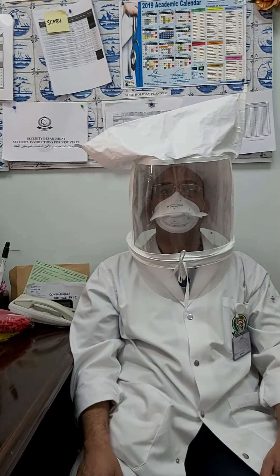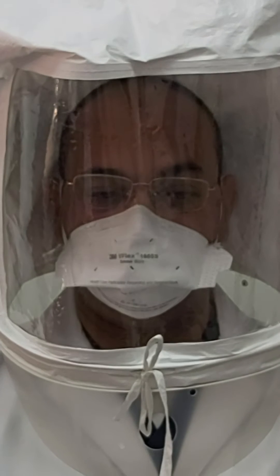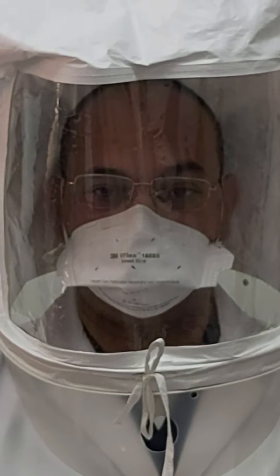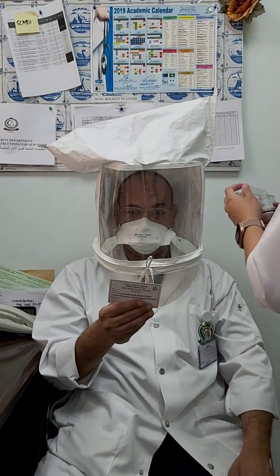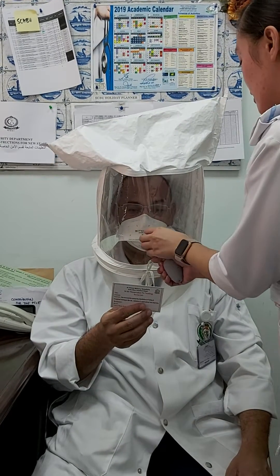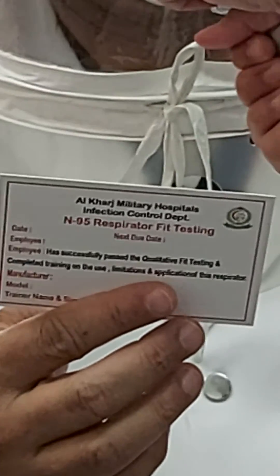Continue, 30 seconds. Next — okay, you didn't taste anything. You hold this one, you read it loudly for 30 seconds. Okay, you read it loudly.